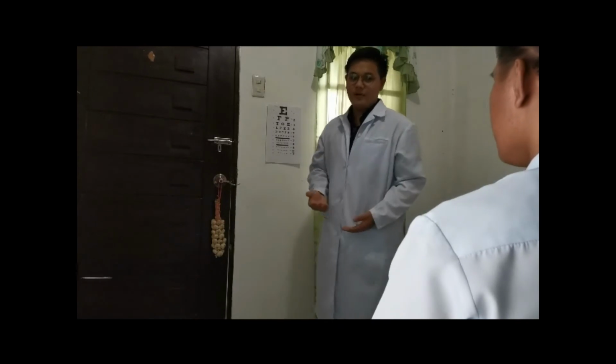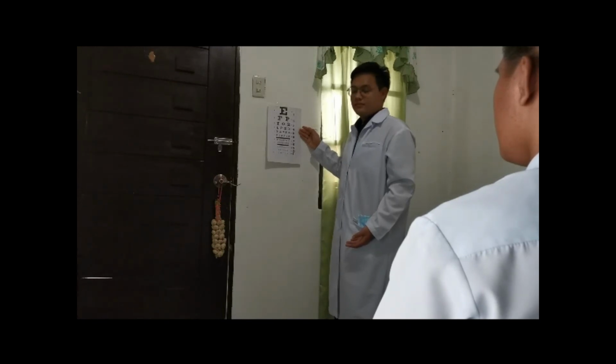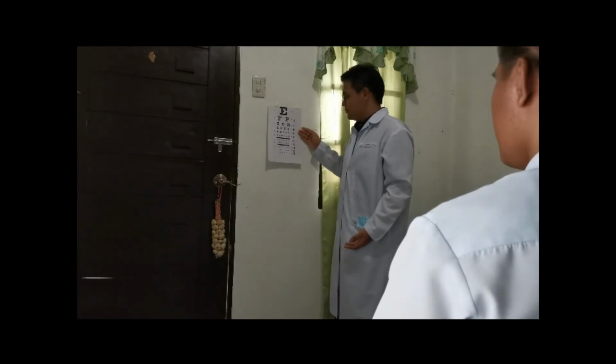Using your both eyes po, pakibasa po. E, F, P, T, O, Z, L, F, E, D, F, E, C, F, D, E, D, F, C, Z, P, F, E, L, O, F, Z, D. Okay sir, thank you po.